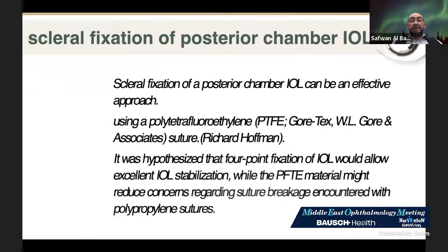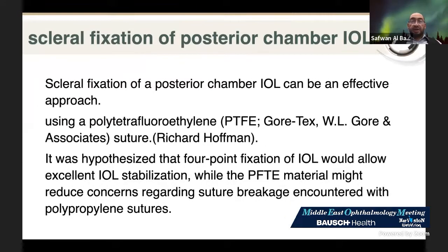And scleral fixation of a posterior chamber IOL can be an effective approach using polytetrafluoroethylene, as Dr. Carlos mentioned, which is the Gore-Tex suture. I searched for who used it off-label, and the first one who published a few things around it was Professor Richard Hoffman.